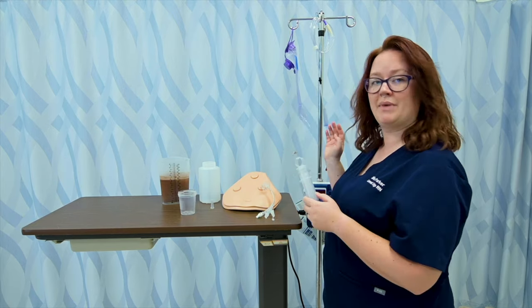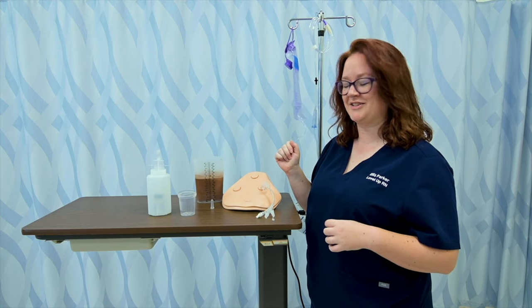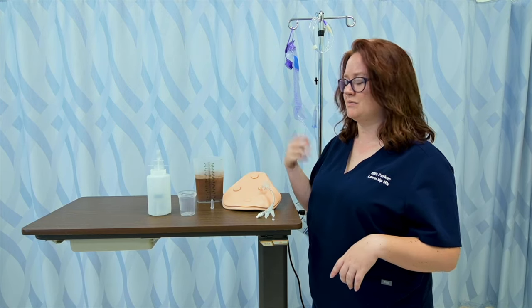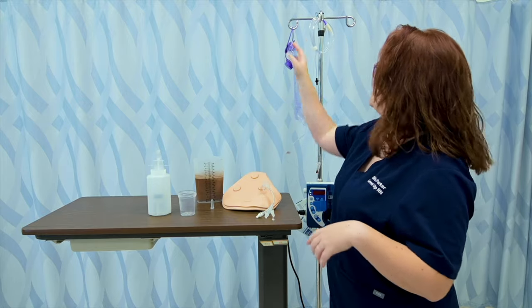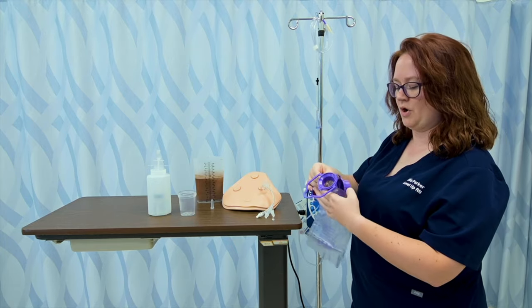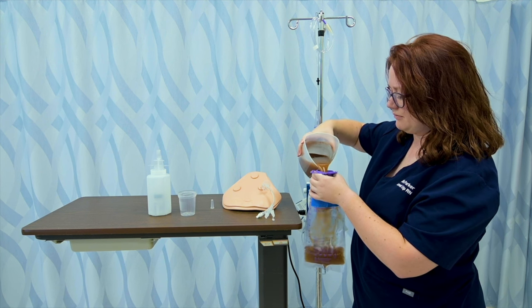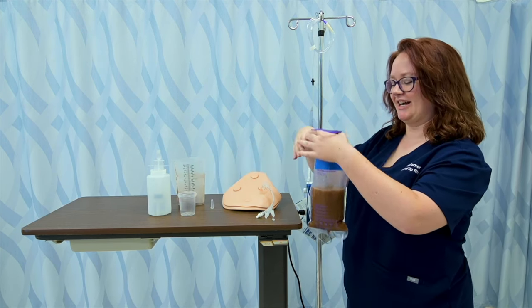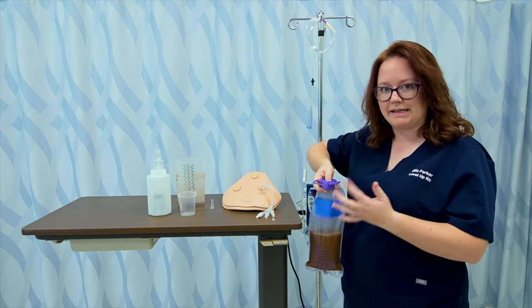So if I need to check GRV according to facility policy, that's how I would do that. Then I'll go ahead and set up my feed bag. For today, I've got this graduated cylinder of tube feeding — it can come in cans, bottles, or bags. Sometimes I'd need to pour it out; other times I can flip the cap off a bottle and put tubing directly in. I'll make sure my tubing is clamped, open the top of my tube feeding bag, pour the desired amount in — it looks delicious. Then I'll put the cap on.